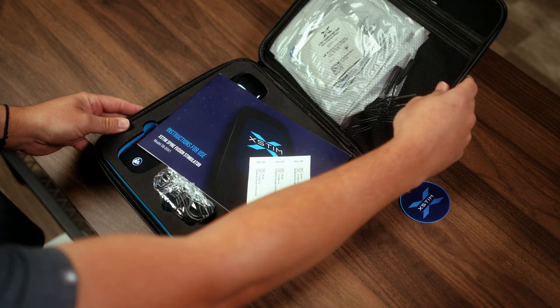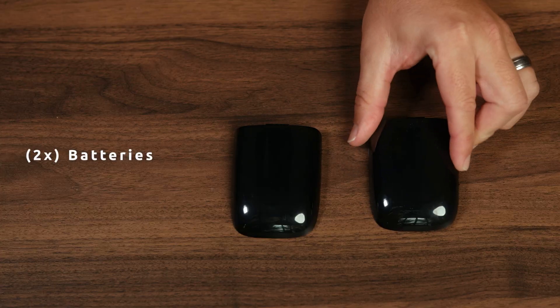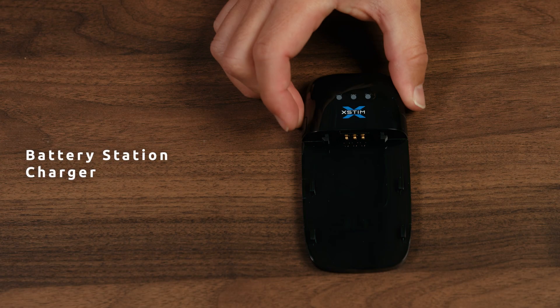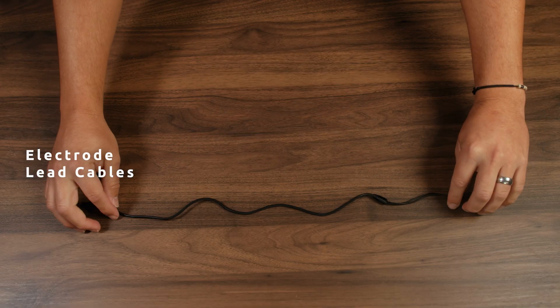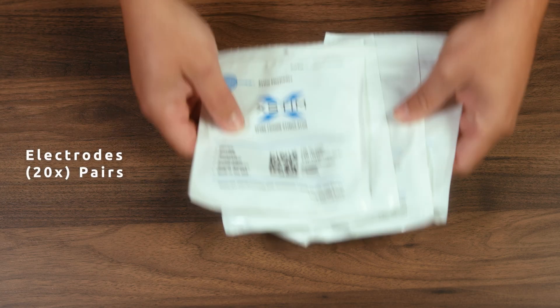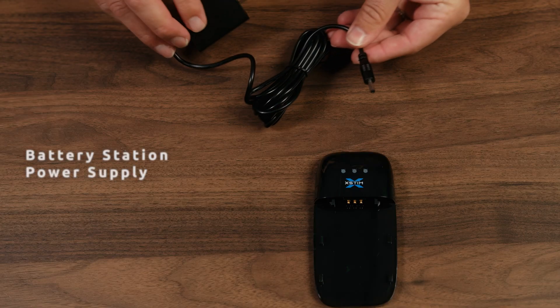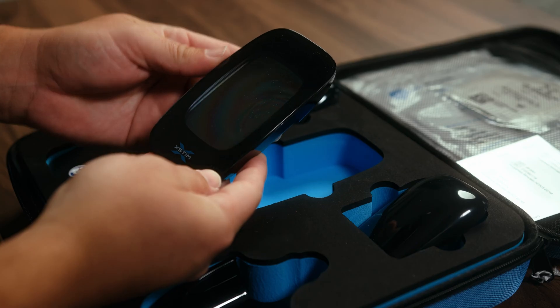Your X-Stim Spine Fusion Stimulator kit includes several components: two batteries, battery station charger, controller, electrode covers, electrode lead cables — one short, one long — electrodes (20 pairs), belt clip, battery station power supply, and travel case. These items are all you need to start your treatment.